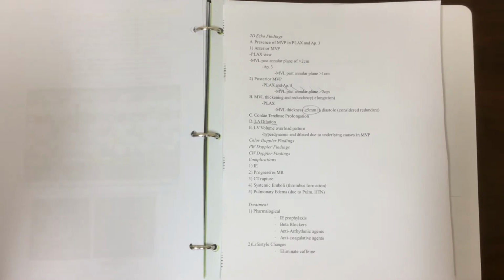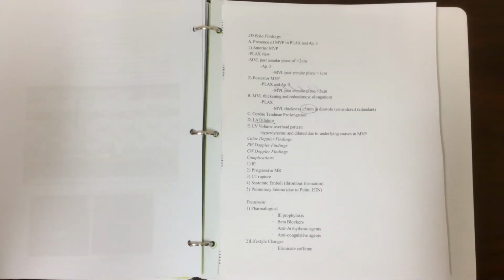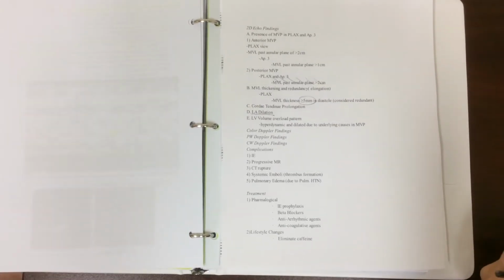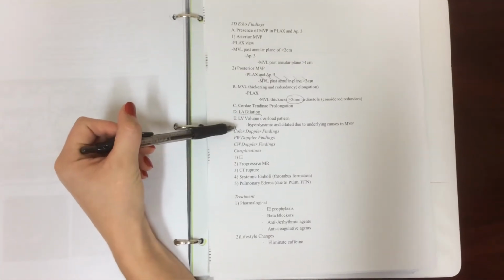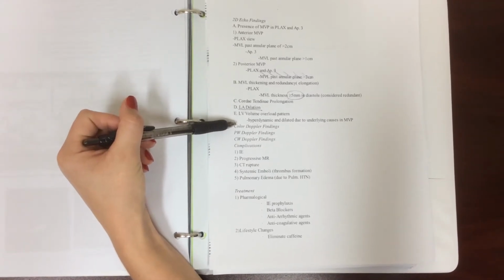You will find mitral valve leaflet thickening and redundancy or elongation in plax, and you will also see it with mitral valve leaflet thickness greater than or equal to 5 millimeters in diastole, which is considered redundant. Some secondary signs you'll see are left atrium dilation, left ventricle volume overload pattern, making the left ventricle hyperdynamic and dilated due to underlying causes of MVP.